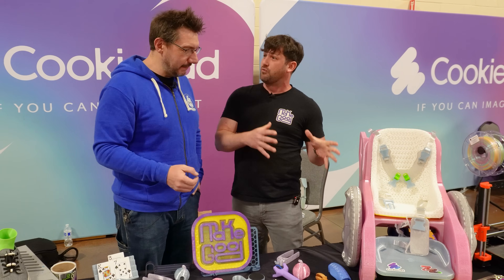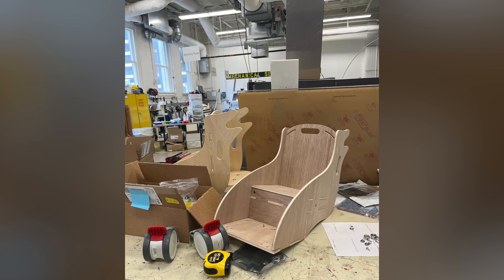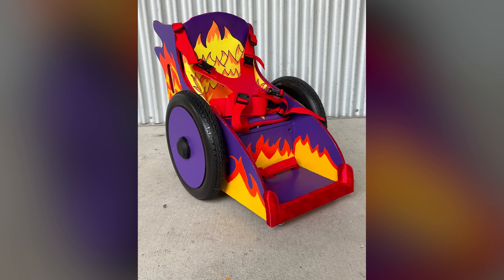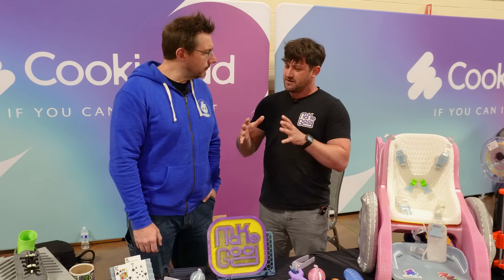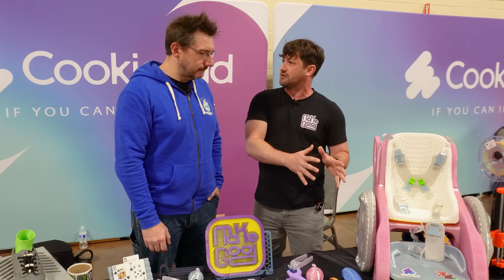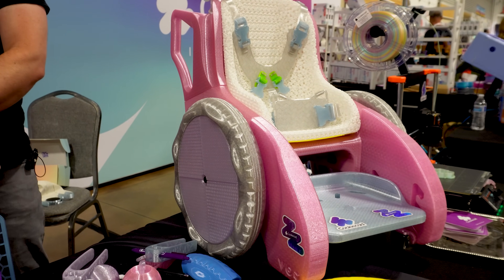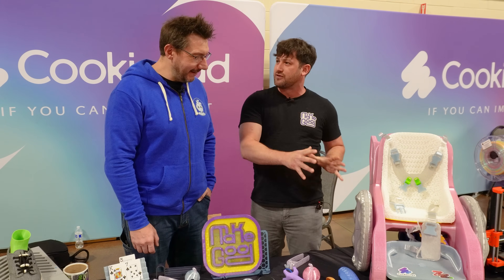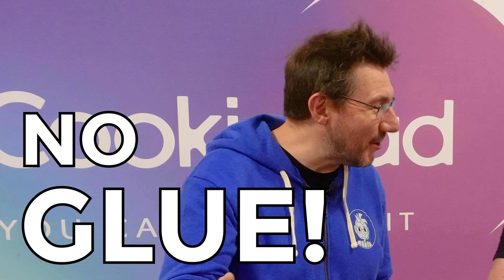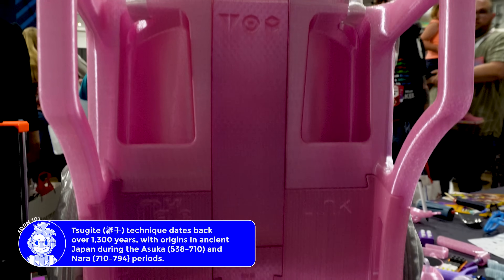We used to make these out of wood with sewn cushions and things, and they worked really great, but they require a lot of work, a lot of labor, finding the right materials — CNC-ing the wood is just a very difficult process. A while ago we were looking around and saying, what if we could make this with just one skill, that skill being 3D printing. We challenged our team to redesign the entire device specifically for additive. And this whole thing goes together without any glue, no fasteners — it's all slot fit with pegs and things like that.